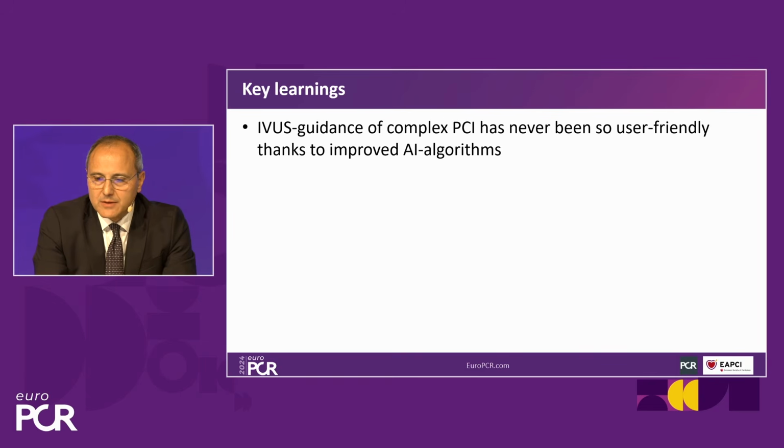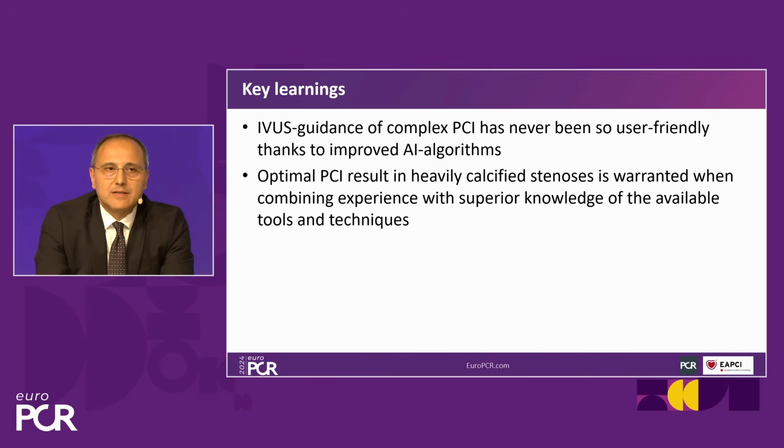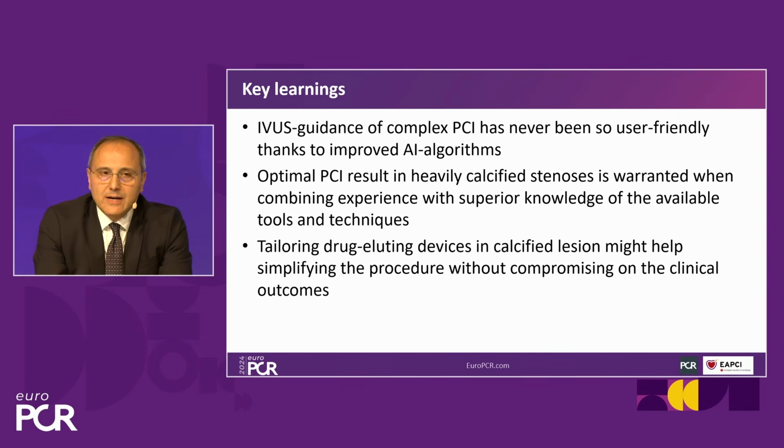IVUS guidance of complex PCI has never been so user-friendly. Of course, we had Vani here that made it even more user-friendly, thanks to the improved AI algorithm. Optimal PCI result in heavily calcified stenosis is warranted when combining experience, because this is something we cannot forget, with superior knowledge of the available tools and techniques. And you have seen how many tools and techniques the team in London have used. And finally, tailoring drug-eluting devices in calcified lesion might help simplify the procedure, which is already complex by itself, without compromising on the clinical outcomes.